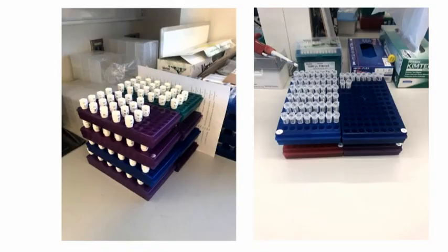Now, the overall method is still quite manual, but that is the nature of the samples, right? These are FFPE samples. They have to be shipped some way. They're curls or cores. I mentioned all that variability. So there is an important logistical, or at least lab, consideration.